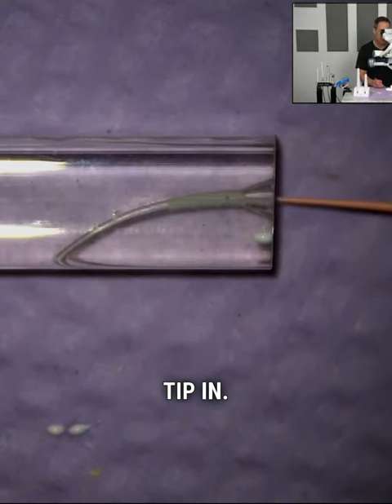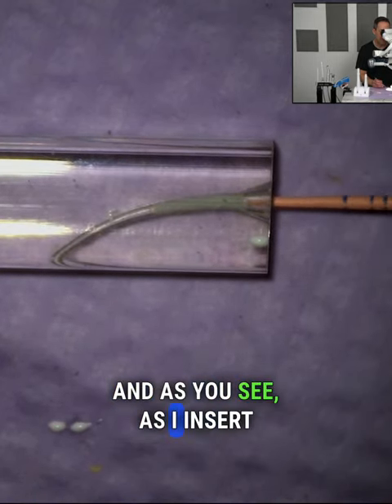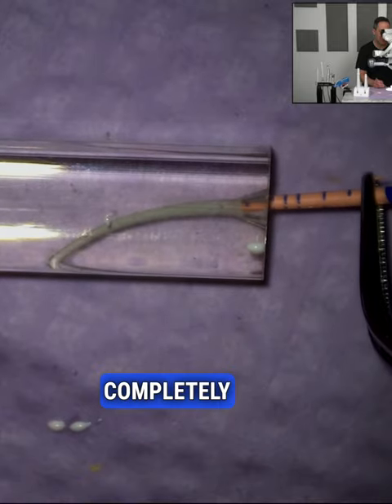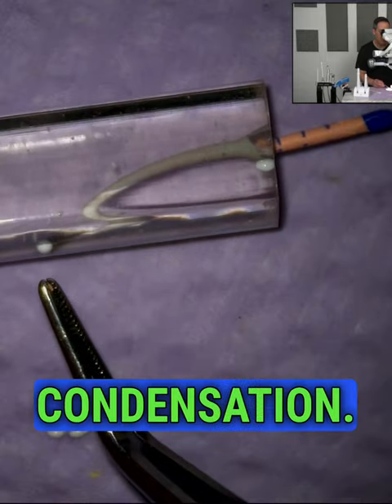I'm going to bring the tip in. Here's the gutta percha going in. It's going to catch into the reservoir of BC sealer. As you see, as I insert it slowly, watch how the sealer completely goes to the end. You can see just a little puff come out of the end there. That's the hydraulic condensation.